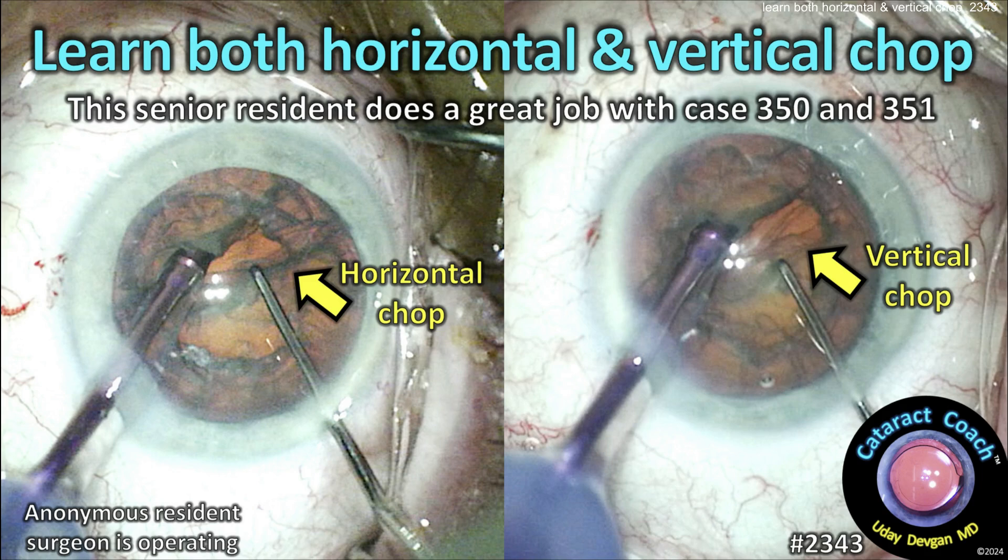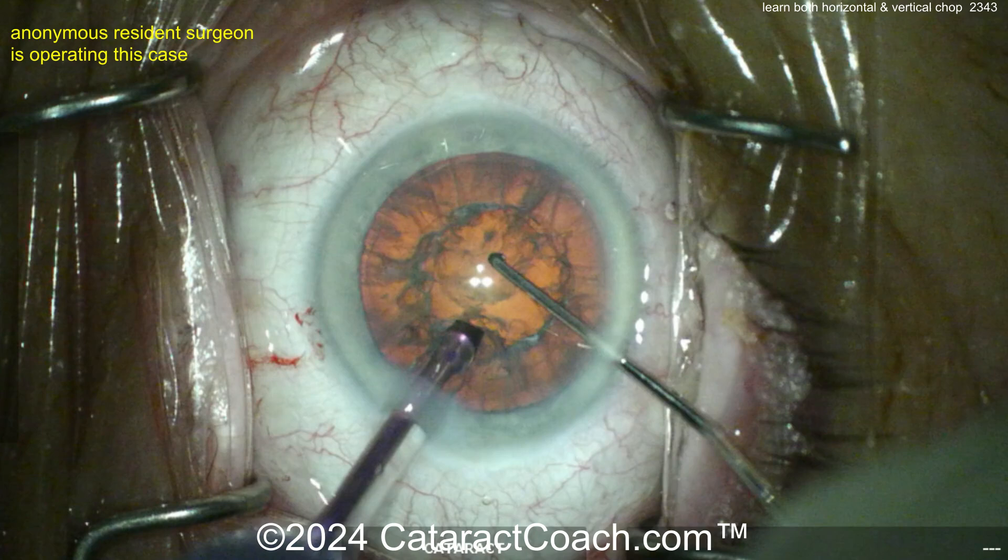cataractcoach.com. Learn both horizontal and vertical chop. This senior resident does a great job with cases 350 and 351.